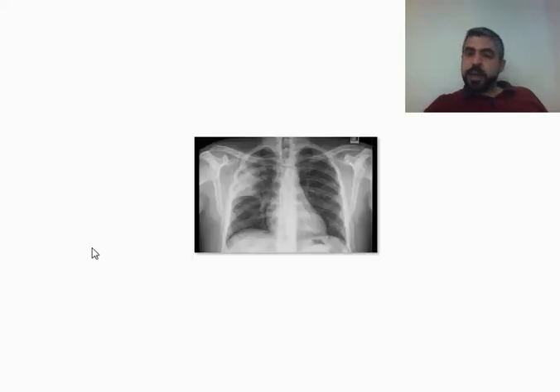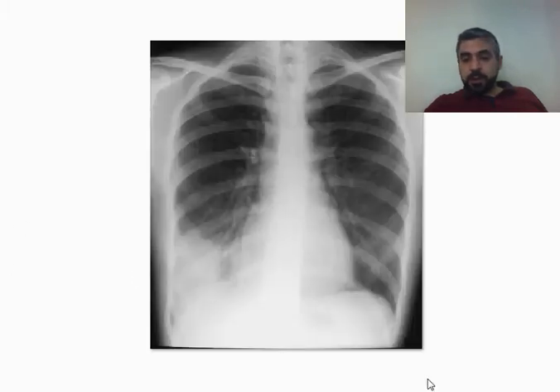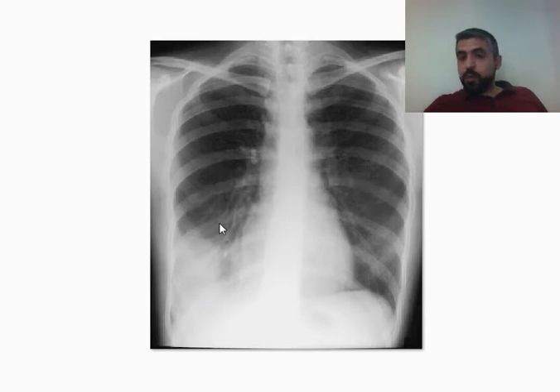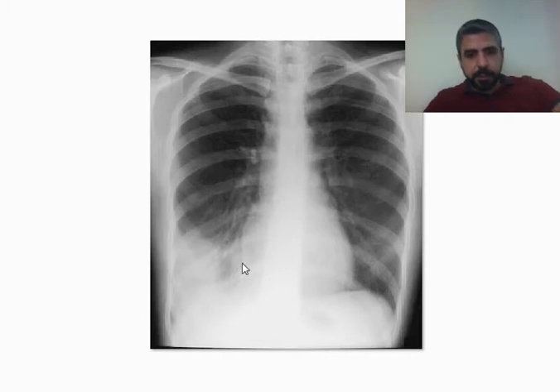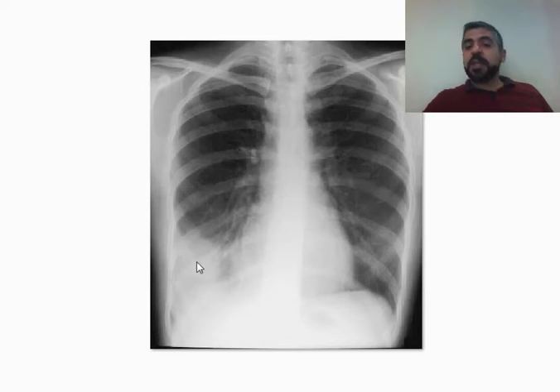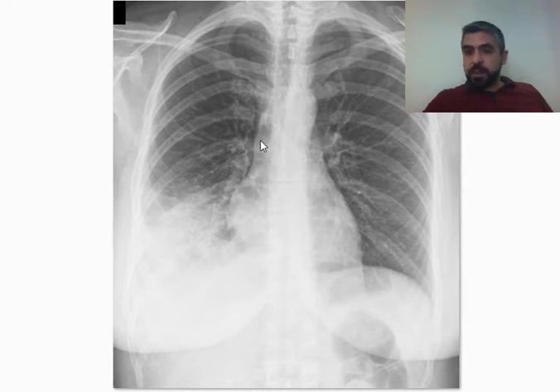Another example — back again to right upper lobe consolidation. You can see the transverse fissure, obvious increased opacity in the right upper lung zone. Now, there is also opacification of the right lower lung zone. We have two lobes there: the middle and the lower lung lobe. The middle silhouettes the heart, not the diaphragm, while the lower lobe silhouettes the diaphragm, not the heart. Can you see the diaphragm? No. Can you see the heart? Yes. This indicates right lower lobe consolidation. In the next example, you can see the right heart border but cannot see the right hemidiaphragm — again indicating right lower lobe consolidation, with the right hemidiaphragm silhouetted.